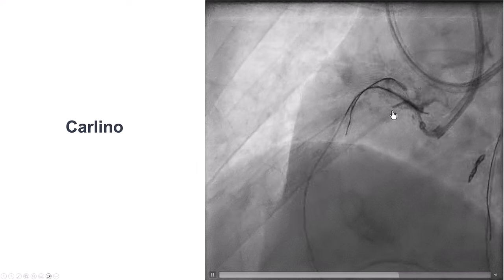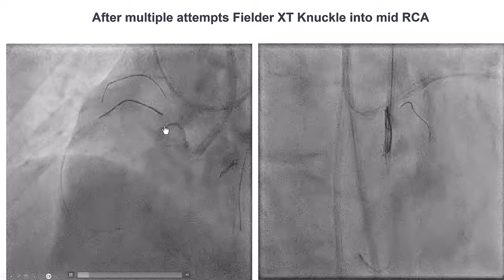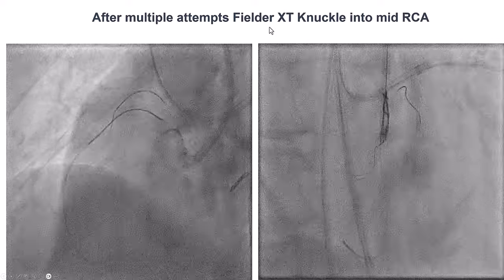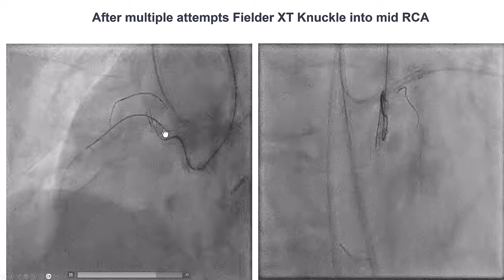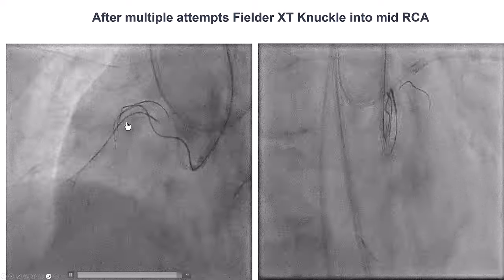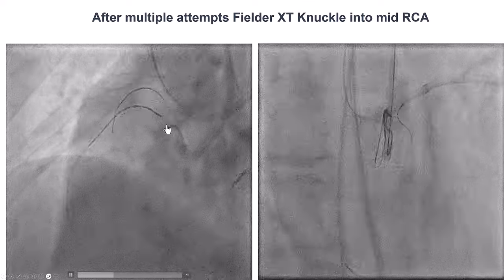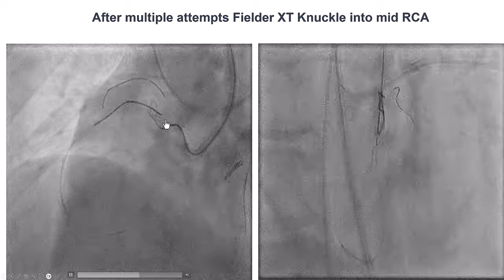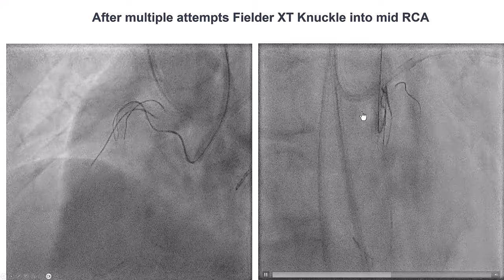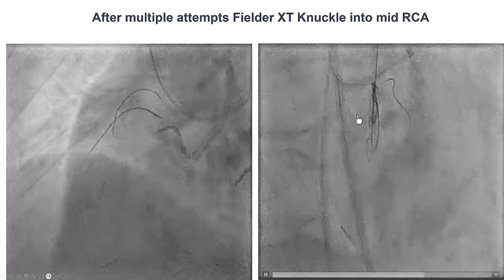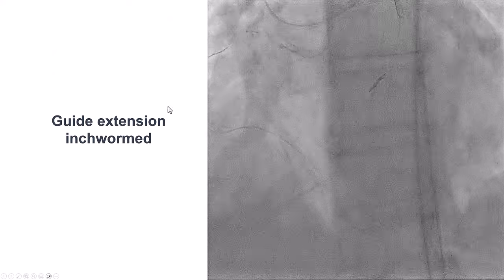We still had a lot of difficulty advancing equipment and used a guide extension — that didn't work. We advanced a microcatheter and did an injection of contrast through it using the Carlino technique. We then tried the Gladius Mongo — that didn't work — but then used a Filderwire XT, which was getting stuck inside the proximal RCA. Eventually a knuckle formed, and the knuckle appeared to be moving along the course of the RCA. This revealed why we had all the difficulty: a very tortuous proximal right coronary artery with a lot of bends. The Filderwire XT finally released and traveled along the course of the RCA. A contralateral orthogonal injection confirmed good movement of the wire alongside the retrograde guide wire.